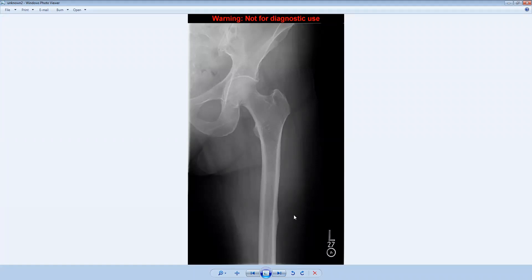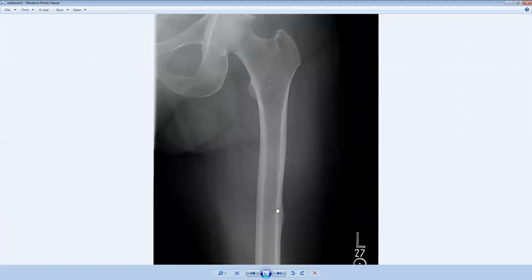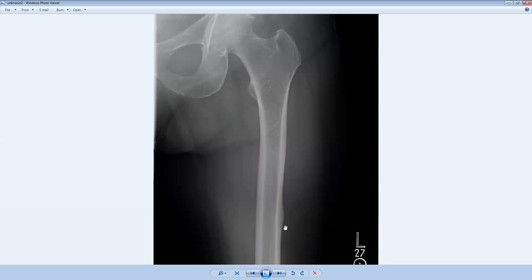But if we look a little closer at the subtrochanteric femur, we can see that there's a focal area of cortical thickening laterally along the femoral cortex, and there's a differential diagnosis for this.